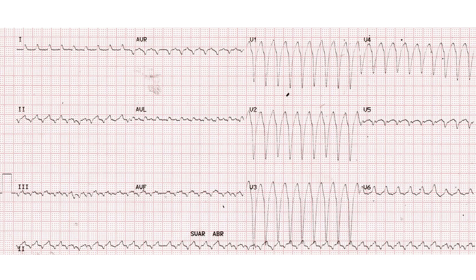Lead 2 shows multiple irregularities in the baseline which could be dissociated P waves. The atrial rate calculated from the dissociated P waves seems to be similar to that of the tachycardia rate, though one cannot be very sure as to which irregularities are P waves and which are artifacts.